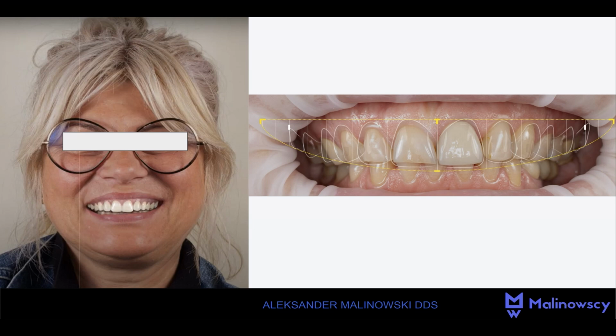At this stage, it's worth calling the patients back and showing them the project and choosing the style of the teeth in accordance with the patient's preferences. The program works based on a flat photo, but it generates three-dimensional STL files that the technicians can use in ExoCAD. I wish that in the next few months, RayFace software will allow us something similar.